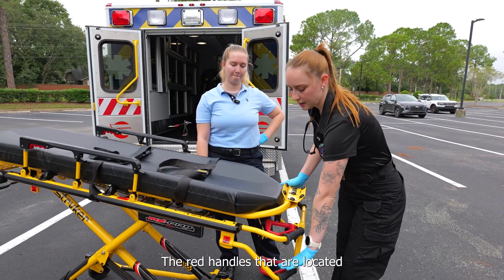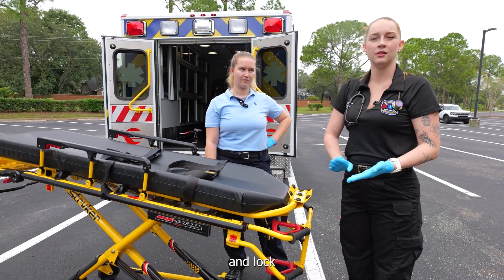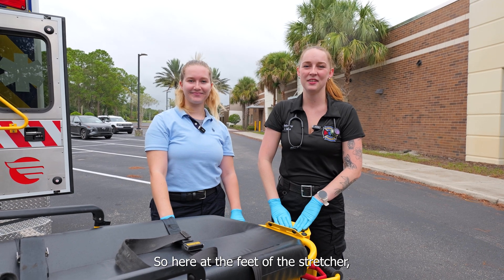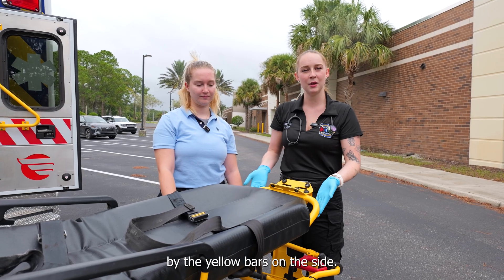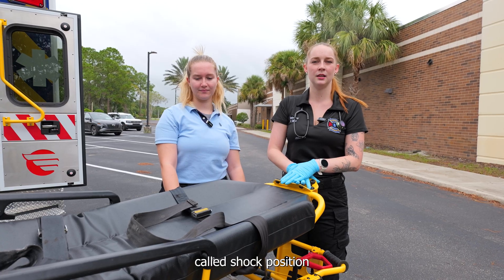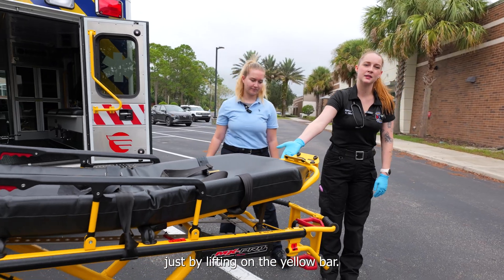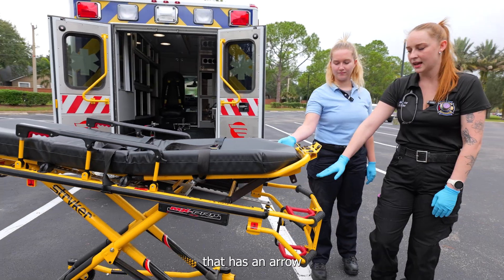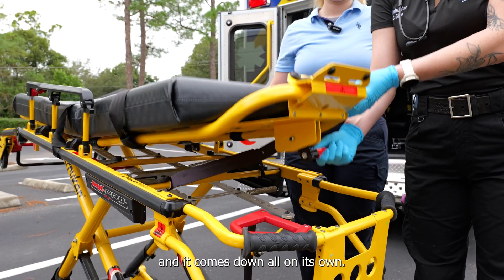The red handles located here on the left-hand side do the same exact thing — this is where we unlock and lock the pins in place that move the stretcher up and down. Here at the feet of the stretcher, we have the option of elevating the legs. We just raise it up by the yellow bars on the side. This helps put our patient into shock position so that we can continue shock management. We can raise it just by lifting on the yellow bar, but to bring it down we have a lever on the bottom with an arrow and unlocking icon where we pull up and it comes down on its own.